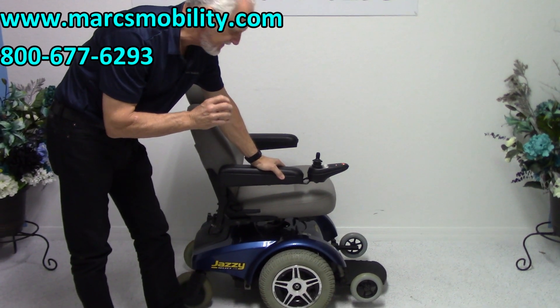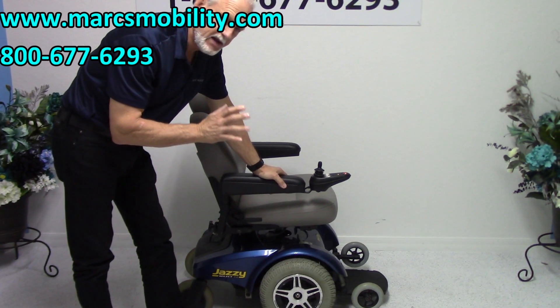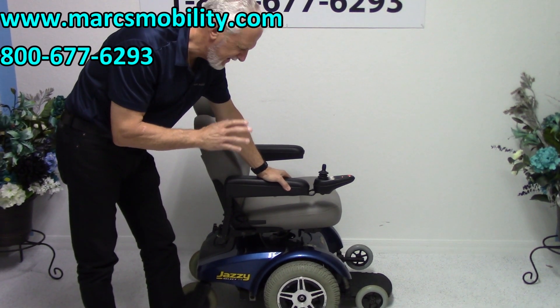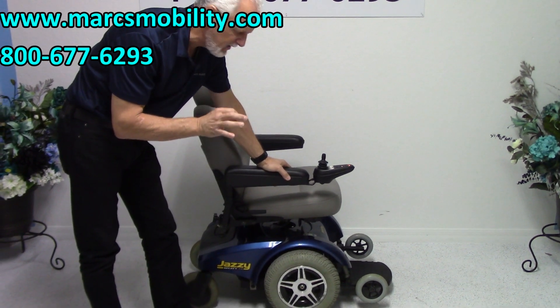This is a Jazzy Select 14, an owner model. This is a really basic power chair — very easy to drive, really nice, and very dependable.